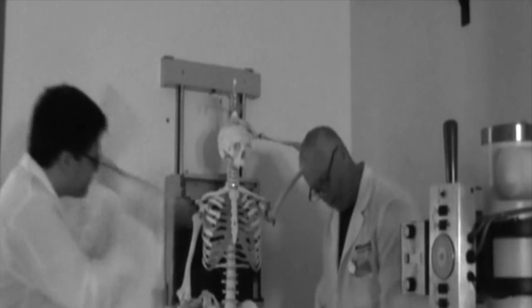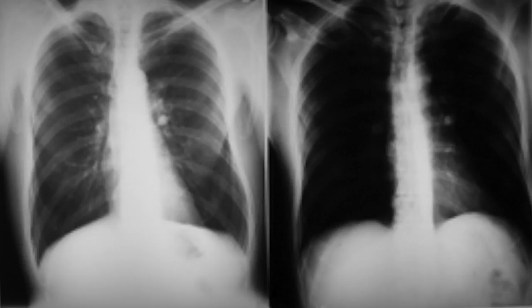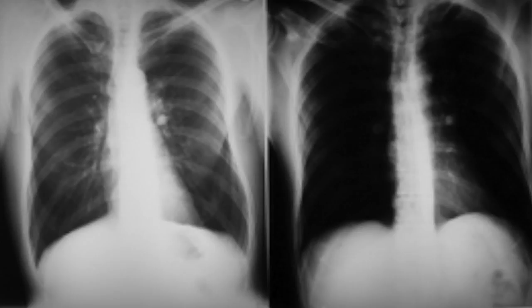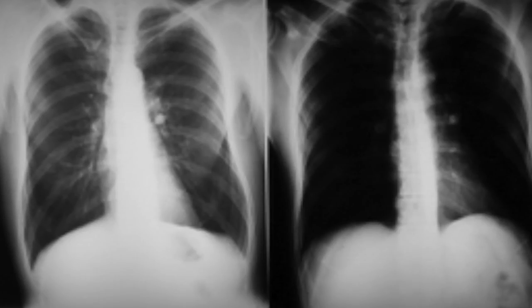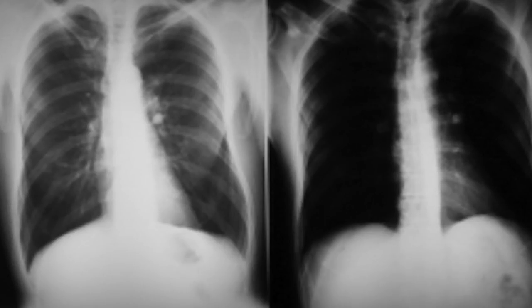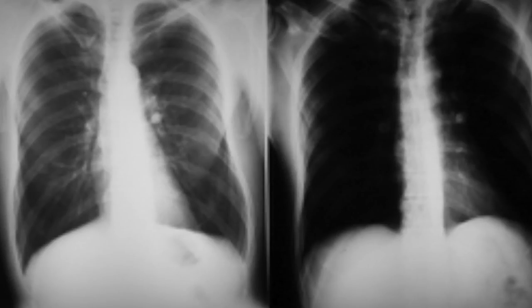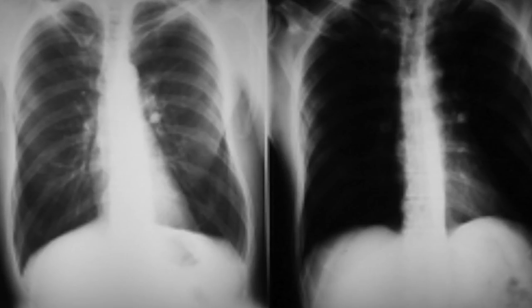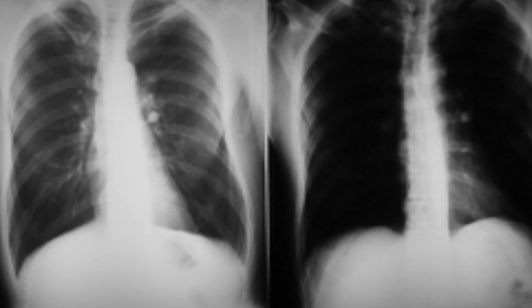Now, as you can see, we did kind of mock what might actually happen, but in reality, if we don't do our jobs correctly, there will be cases where we have underexposures and overexposures. In these images here, you can see the image on the left is properly exposed, and you can see all the anatomy of interest. Whereas in the image on the right, the image is overexposed and there is too much density, and information regarding the anatomy of interest and possible pathology is lost.